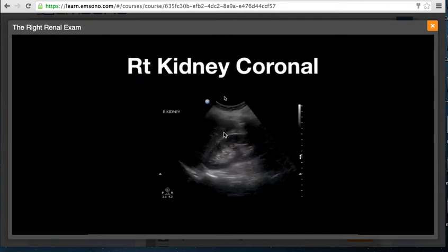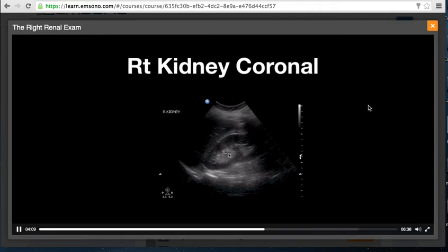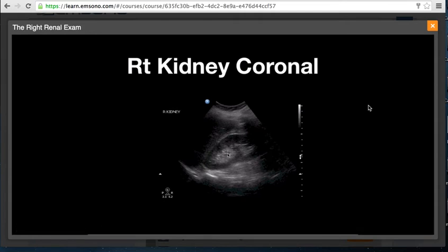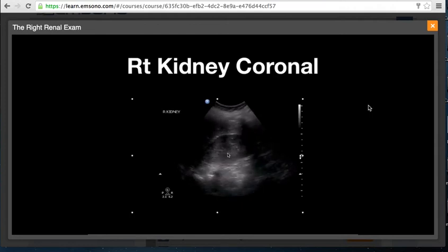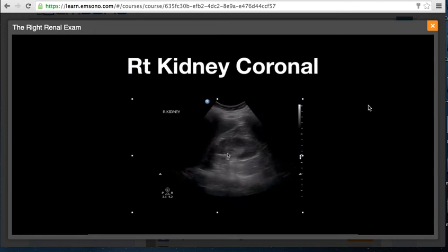Here's a coronal scan through the right kidney — lateral, medial, head, and foot. You've got the liver, the right kidney, the hypoechoic parenchyma, and the hyperechoic pelvis. In order to verify that you're scanning through the renal pelvis, you need to sweep the transducer. As we sweep here, we get a much better look at the renal pelvis, which helps minimize missing subtle degrees of hydronephrosis.